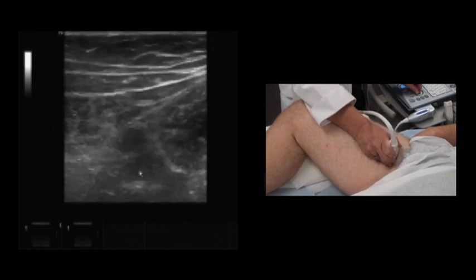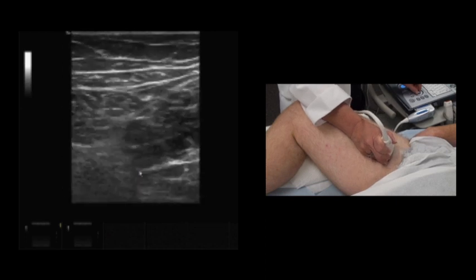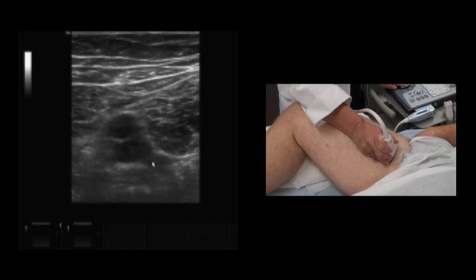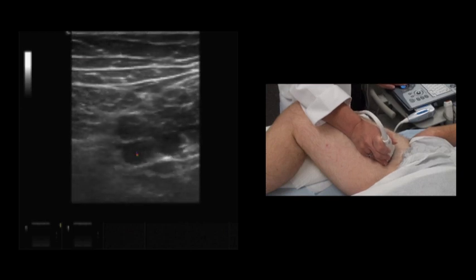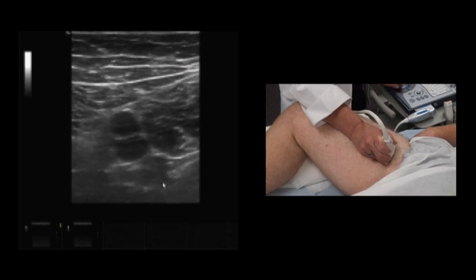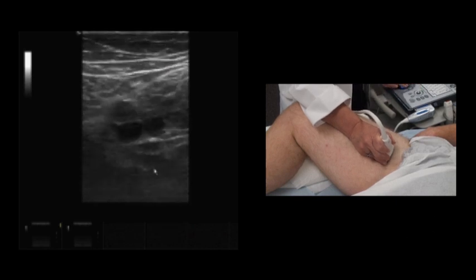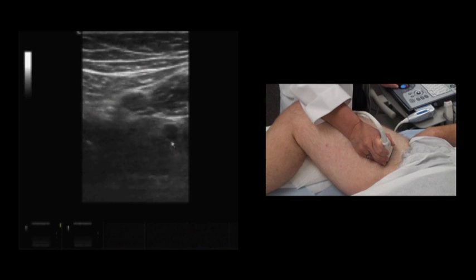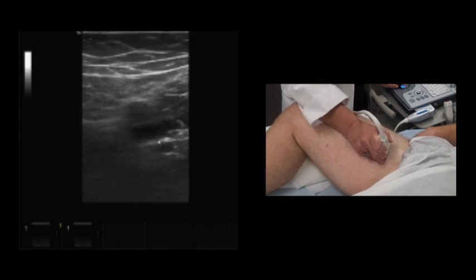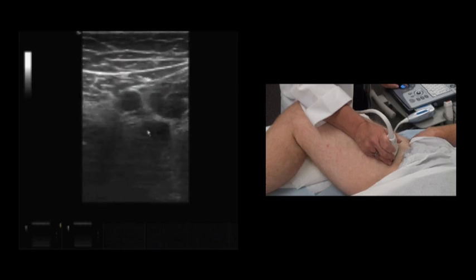And we'll need to adjust our depth as we move on. The vessel dives deeper. We see actually the profunda vein and the superficial femoral vein. And we also see the profunda artery just below the profunda vein, scanning back superiorly.